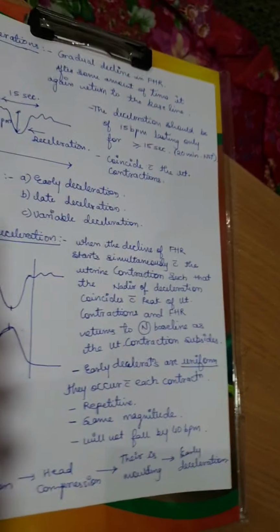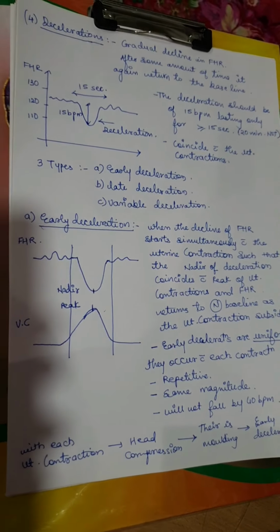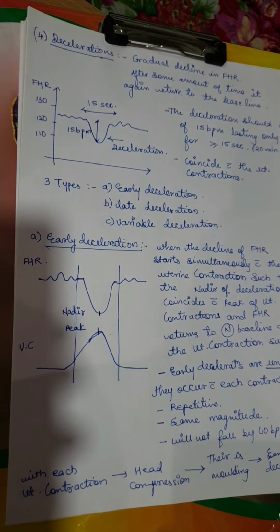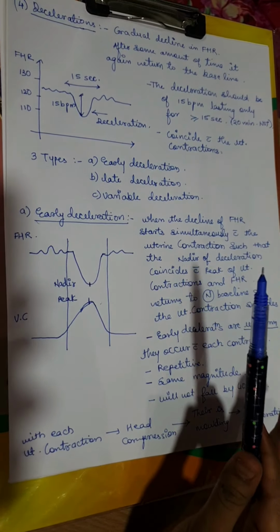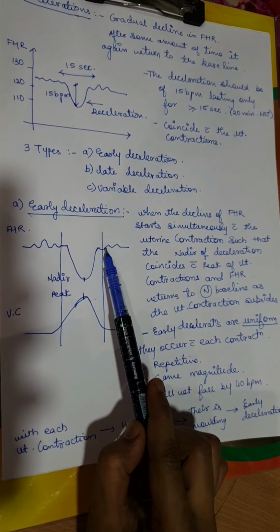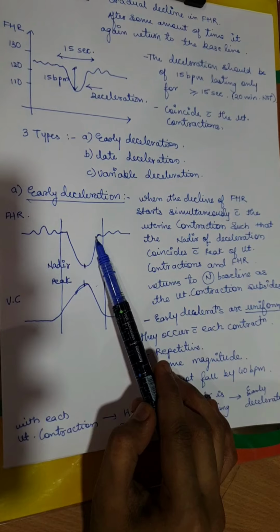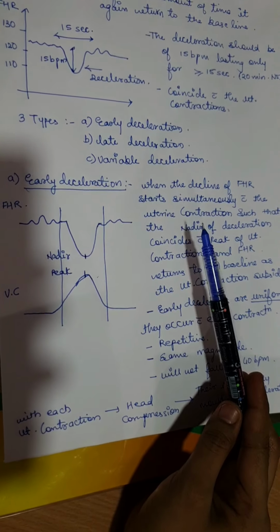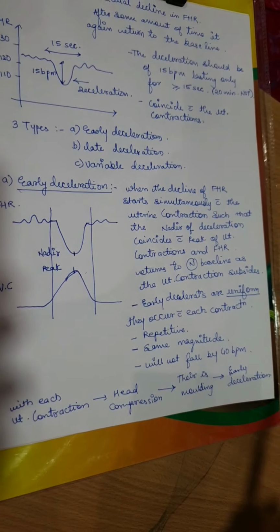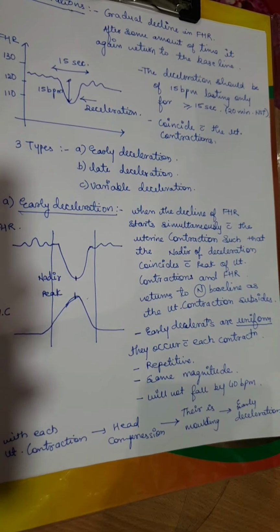Now is it a good sign or a bad sign? It is neither a good sign, nor a bad sign. When you see early deceleration of the same magnitude, returning again to the normal state with the finishing of each contraction, and there is no harm to the fetus or to the mother, there is no need to rush.